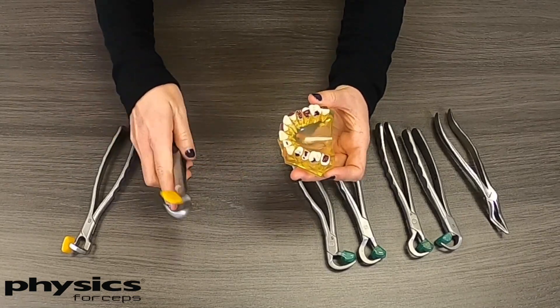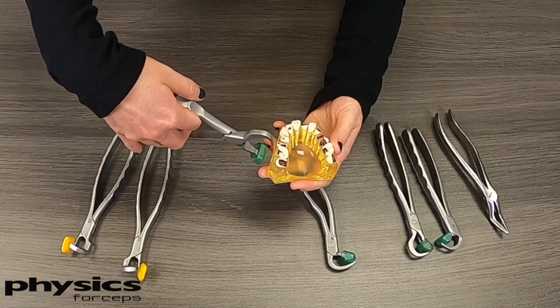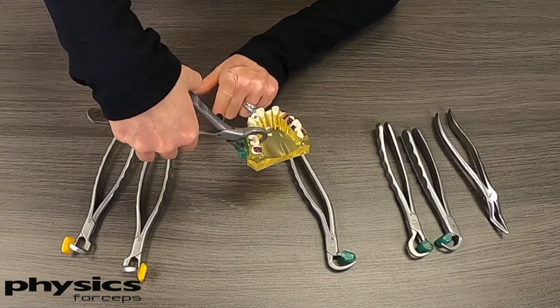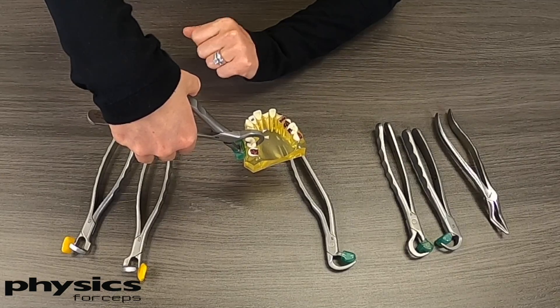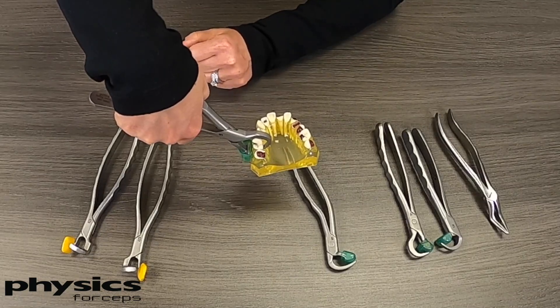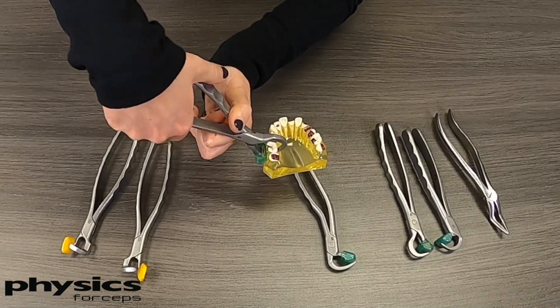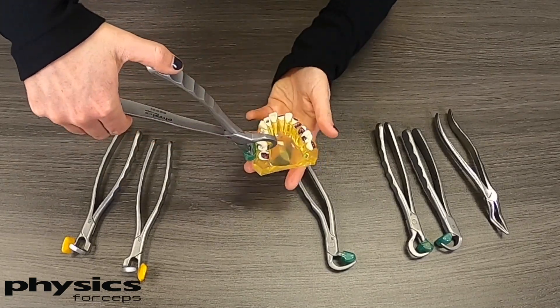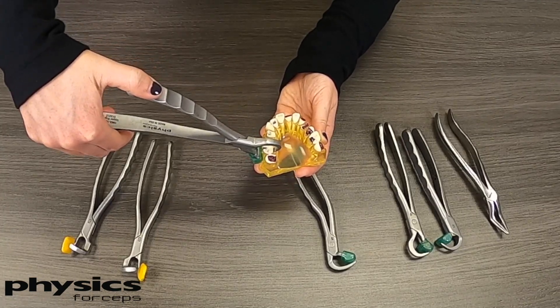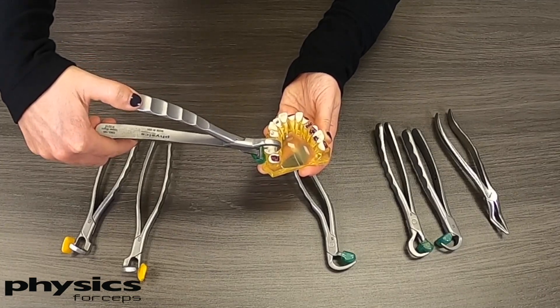A very common question is about buccal plate breaking. When the instruments are placed in the patient's mouth, that bumper is resting on the buccal plate of bone, which many doctors are concerned about. The remedy is to avoid squeezing too tight — that will break the buccal plate. Instead, bring your hands back on the instrument just enough to stabilize it, then slowly rotate until you get one to three millimeters of movement and feel the release of the tooth.